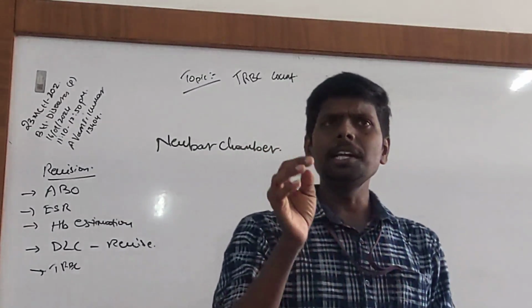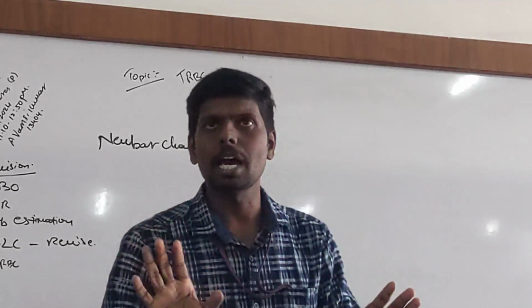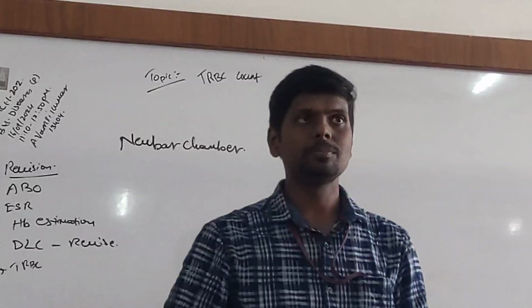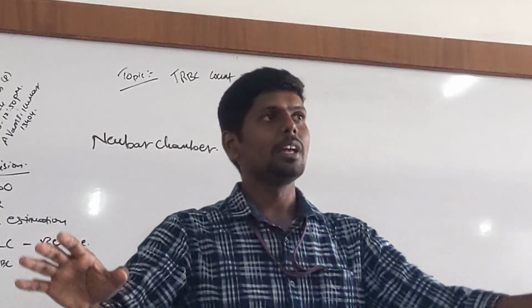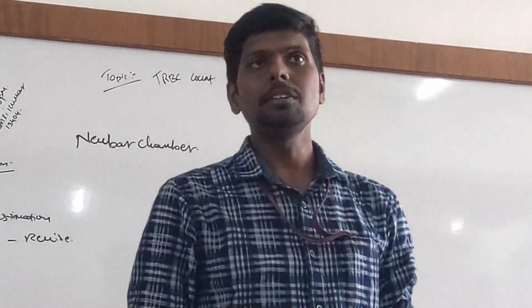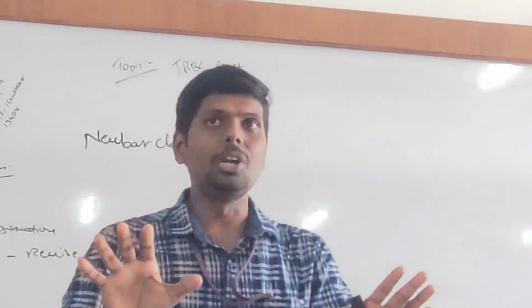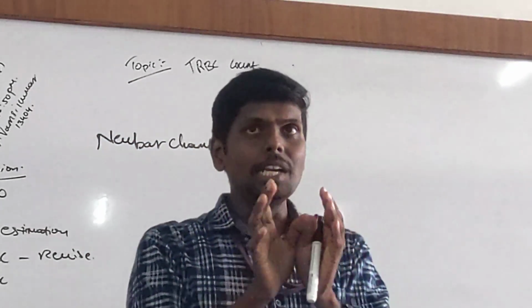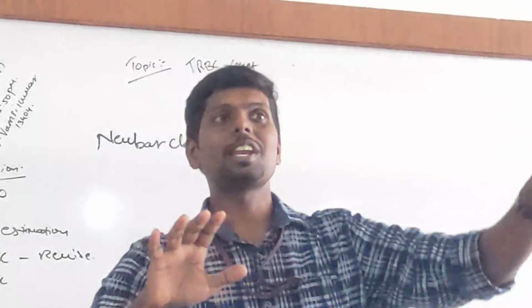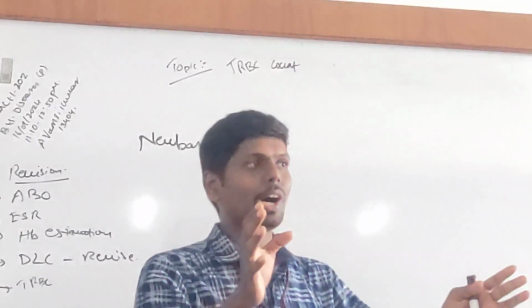Now listen. I already know the size of an average human, maybe 5 feet, and I know the area of this room. So, for example, how many students can fit in this room? Approximately 100 students. First I will guide the students to evenly distribute in the space. I am not going to tell them to concentrate in a corner. You must evenly distribute in a known space. So you have distributed in this room.